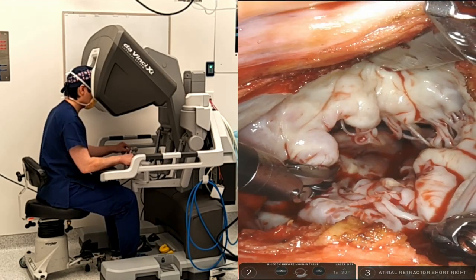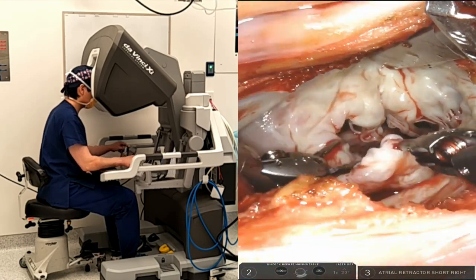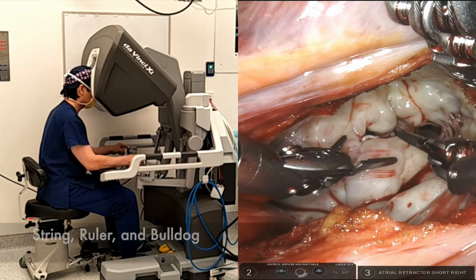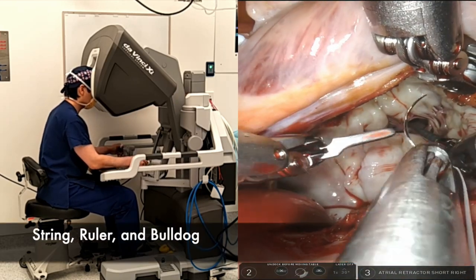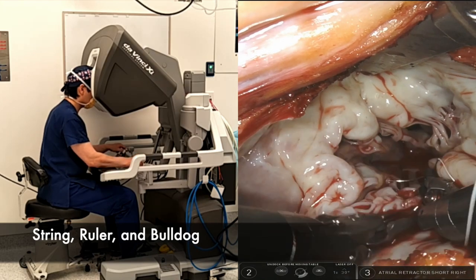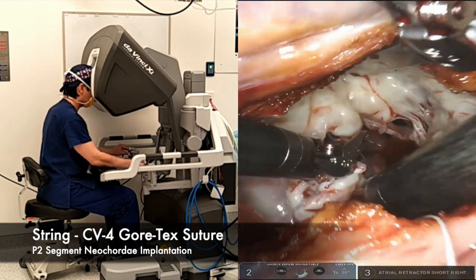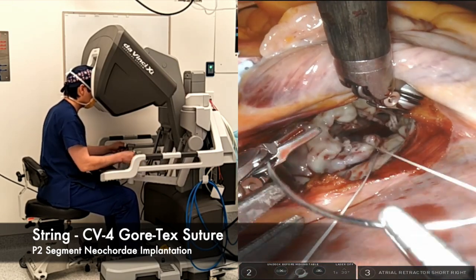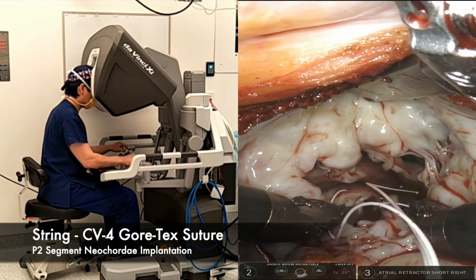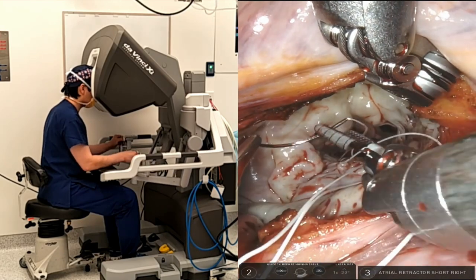The robotic neo-cord implantation technique demonstrated in this case involves three simple steps using a string, a ruler, and a bulldog on a leash. Step 1: A string is a CV-4 Gore-Tex suture. I identify a sturdy papillary muscle and pass the suture through the fibrotic part of the muscle in a figure-8 configuration. Then I use the same needle passing through the free edge of the prolapsing segment twice.